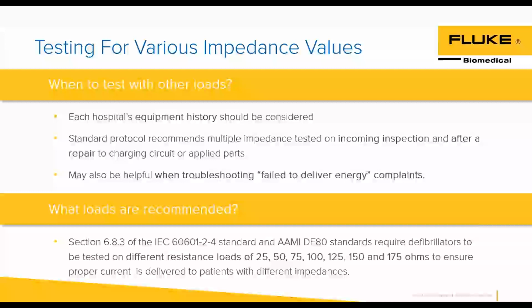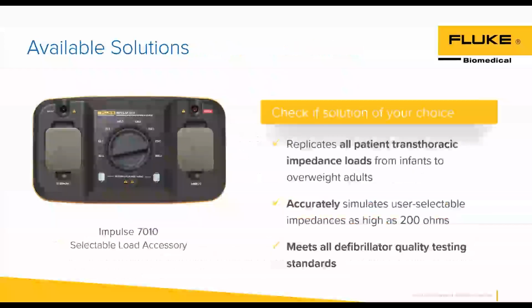So what does this device look like? Let's roll into the next slide here. This is a solution. This just happens to be the Fluke solution. This is an addition to your defib analyzer. It's going to sit below it, connect to it, and allow you to select these different resistances.